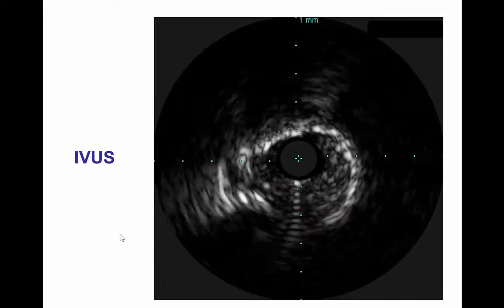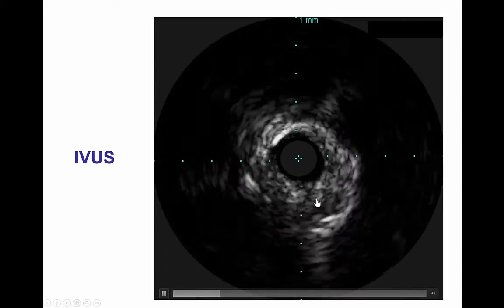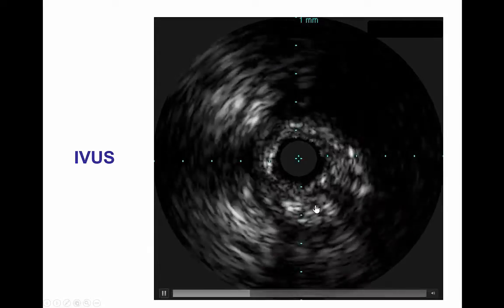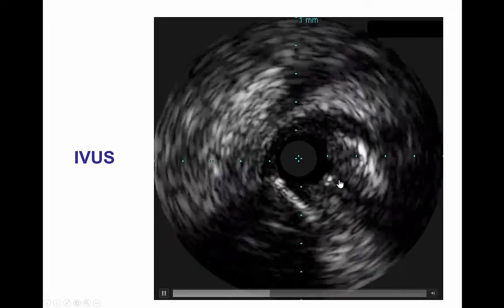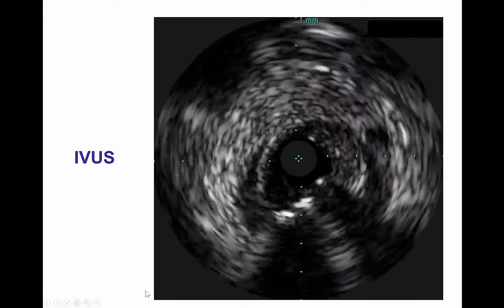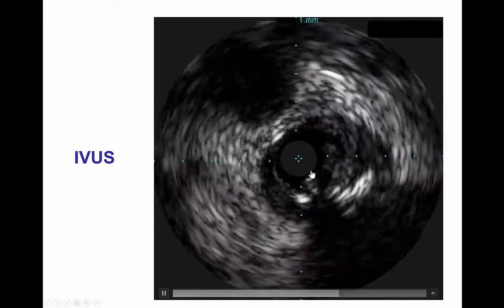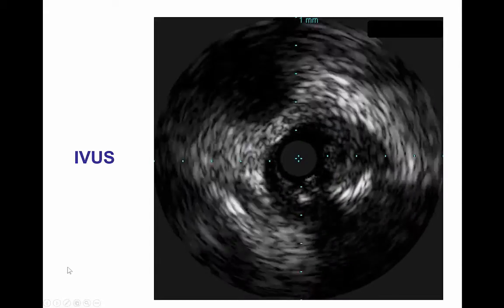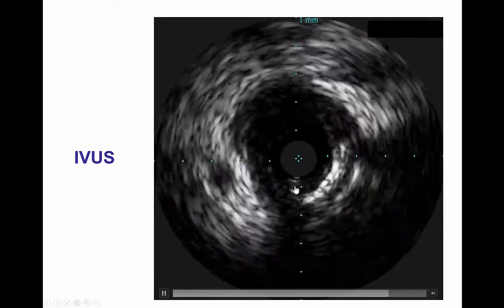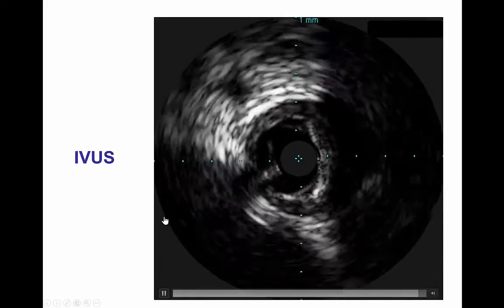We performed intravascular ultrasound to determine how much microcatheter and wire we had. This is the area where the entrapped microcatheter and wire are. There are wire artifacts with shadowing showing that we do have the entangled guidewire essentially in the middle part of the LAD coming back all the way into the main vessel with the Finecross microcatheter.